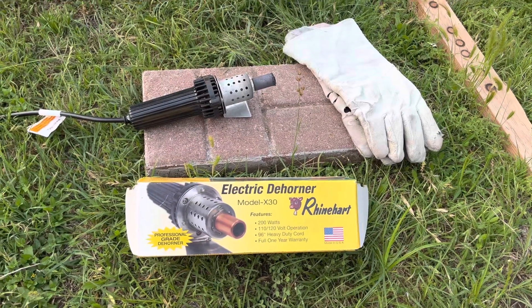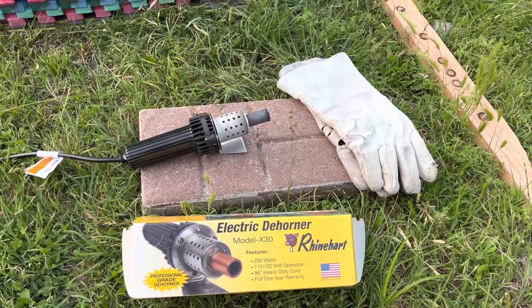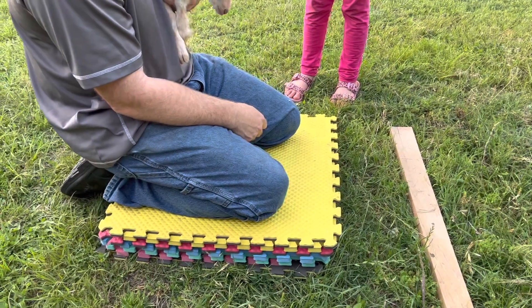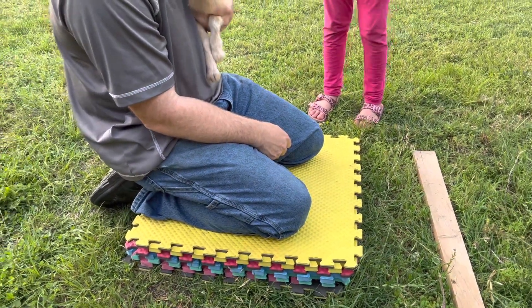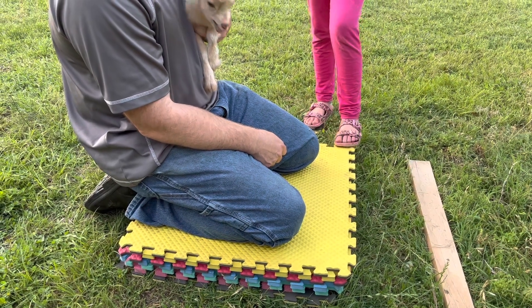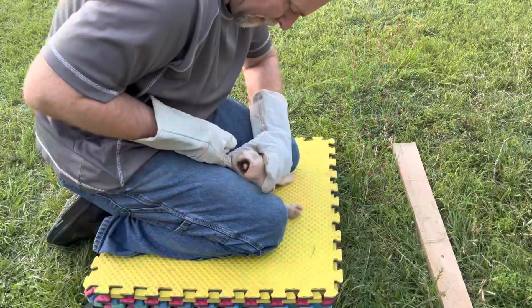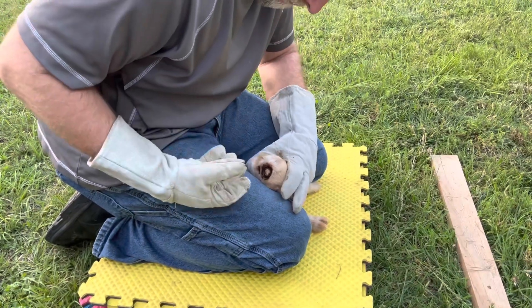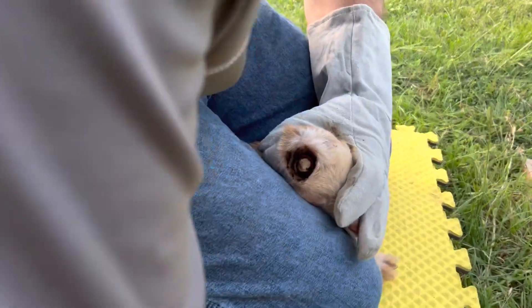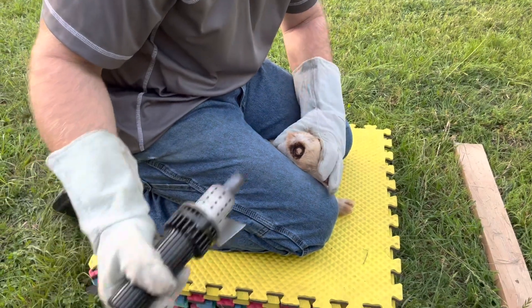We use this Model X30 for our goats — we have Nigerian Dwarfs. You need some heat resistant gloves, and if you're older you might want something to kneel on. He's going to put the baby down between his legs; some people use a box but he kind of prefers to control more of their body. We think of this kind of like a surgery, something that's kind of necessary. She's got one side done now, and that's what you look for — kind of a copper colored ring, kind of an orangish color. Anyway, he's going to go ahead and do the second side.